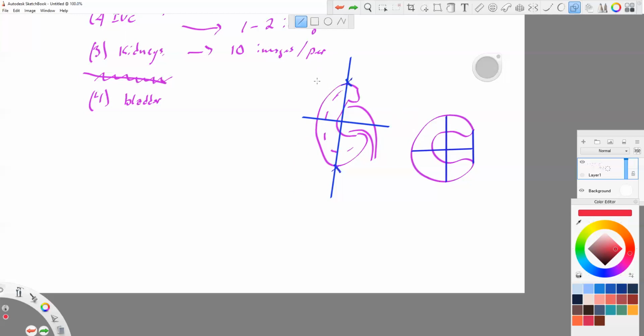So I'm scanning out beyond the kidney because, well, here, let me draw something in, which happens all the time. Exophytic cyst on the outside of the kidney. Maybe even a tumor on the edge of the kidney. And so you want to be seeing that, so you're going to look beyond the kidney.